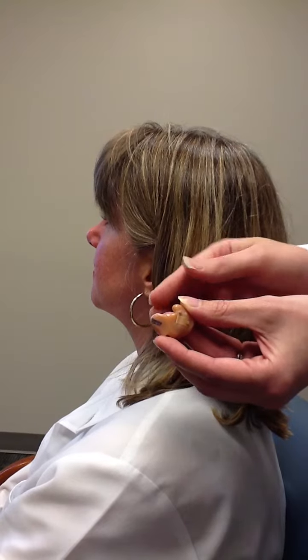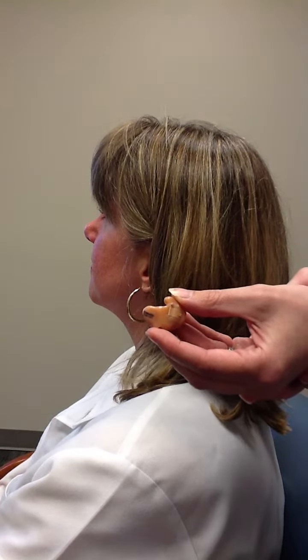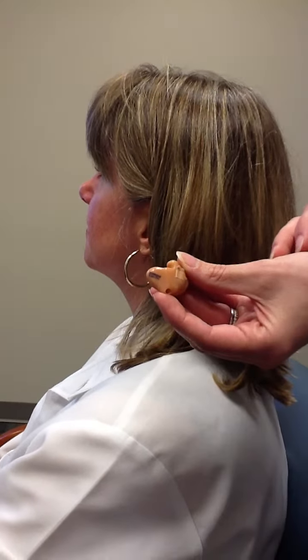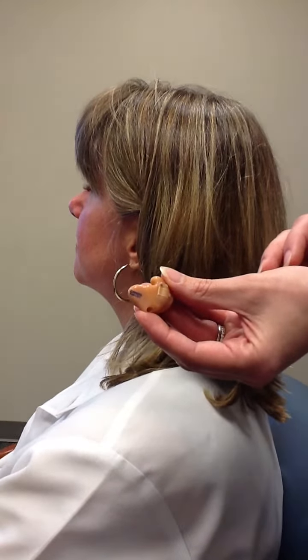This portion here is the canal portion — that's the part that goes into the ear. You'll notice on the canal portion there's blue writing. Blue is for left, and red is for right.